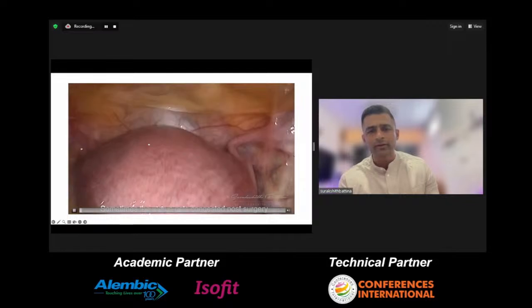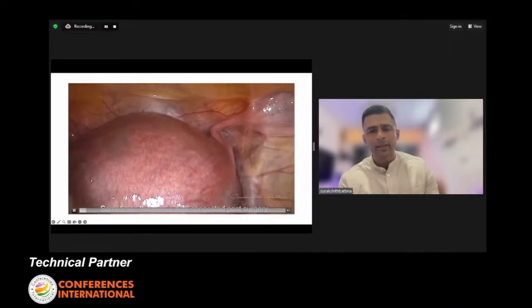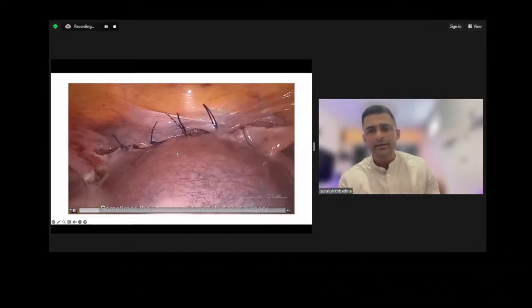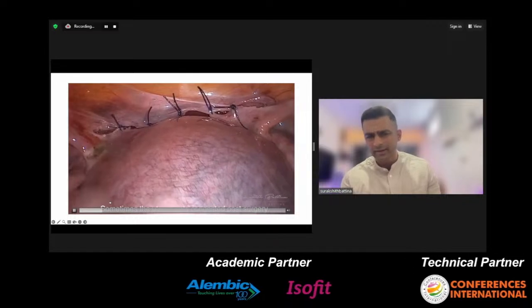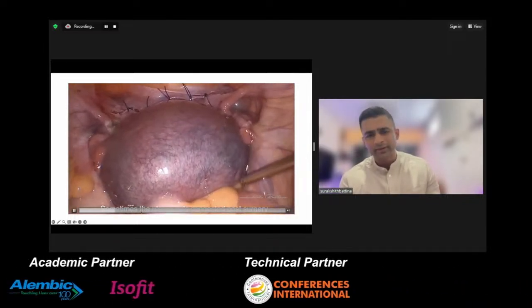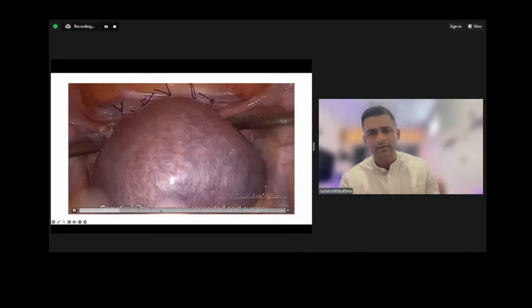I also found that once we have done the procedure, look, the uterus looks quite normal right now, but after a while you see how congested it has become. This has also happened in a couple of cases, but it doesn't really matter, because it didn't change or affect the outcome of the pregnancy. So I don't think it's something we need to be bothered about too much, if you find this kind of congestion.